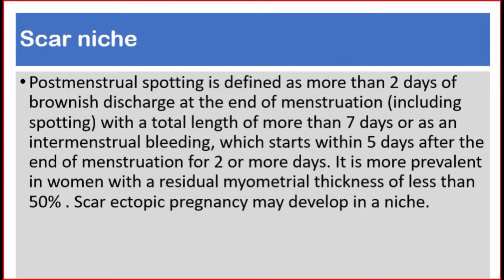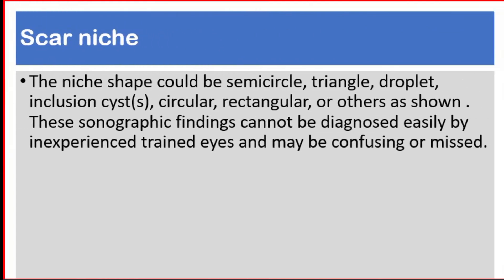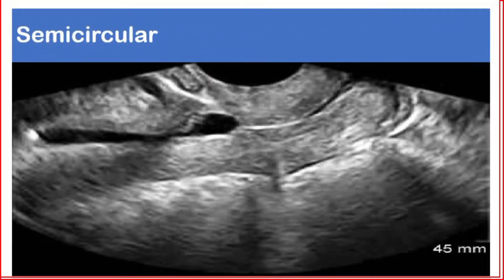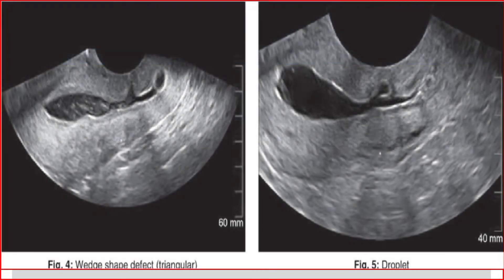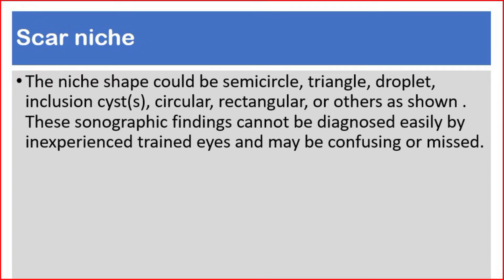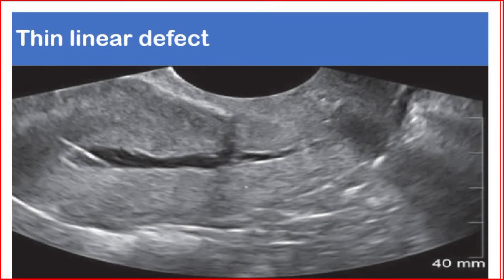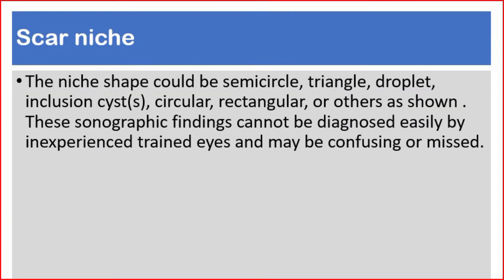Scar ectopic pregnancy may develop in a niche. The niche shape could be semicircle, triangular, droplet, inclusion cysts, circular, rectangular, or others as shown. These sonographic findings cannot be diagnosed easily by inexperienced eyes and may be confusing or missed.